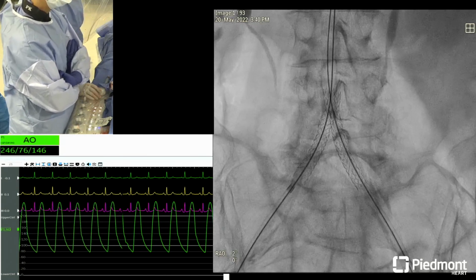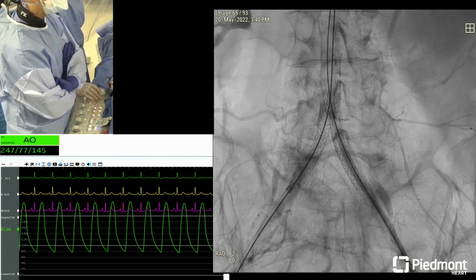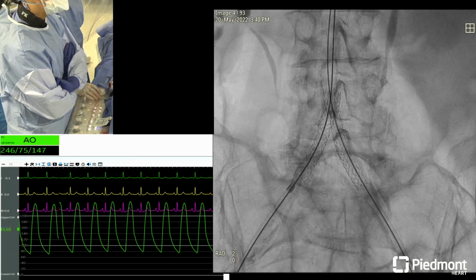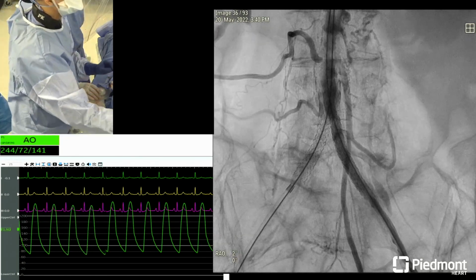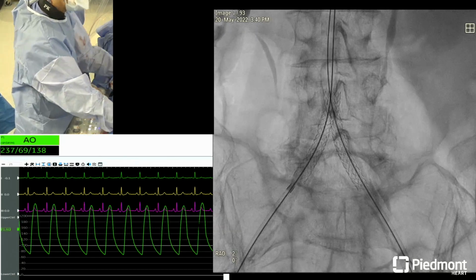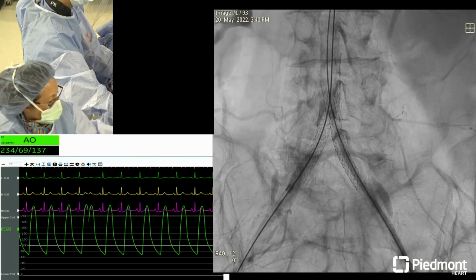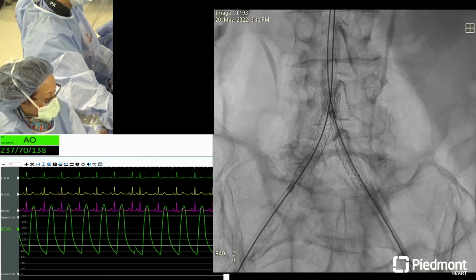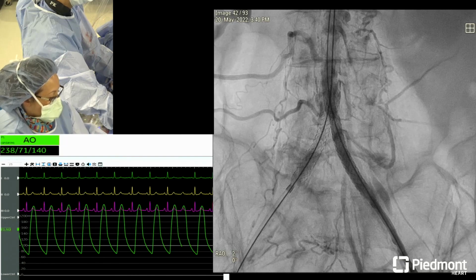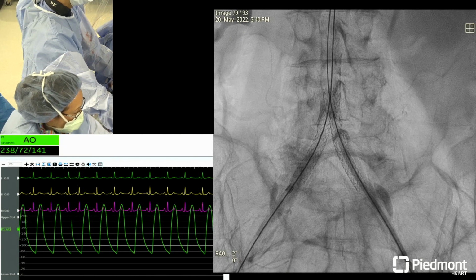Let me ask a question. You have some flow around your dissection antegrade. Does that bother you at all? Will you make the proximal struts any bigger, or will you just leave it be and allow it to heal? My feeling on that is probably maybe just try an 8 balloon up there and just tack it a little bit more. There's definitely some flow around it. I think it will heal with a little bit of time. Some of that was the subintimal technique getting around, so there's definitely a lot of swirling around there.